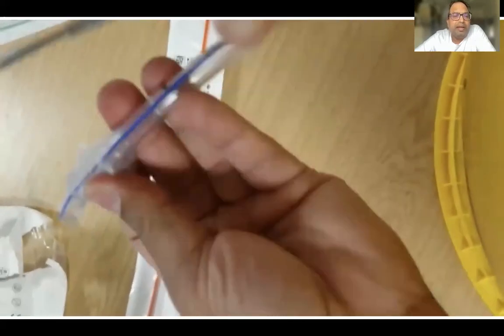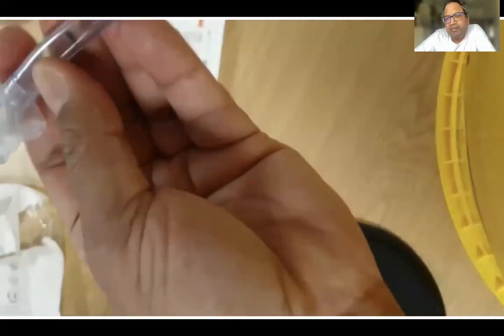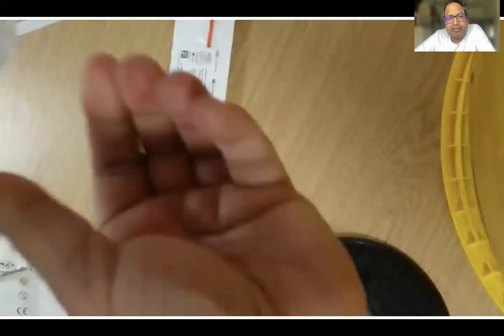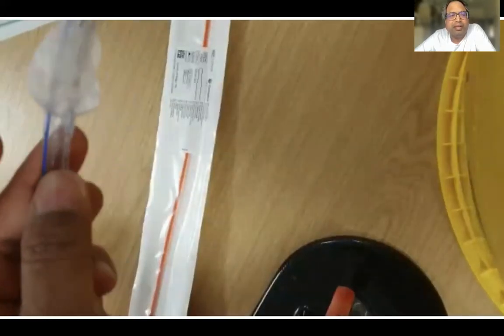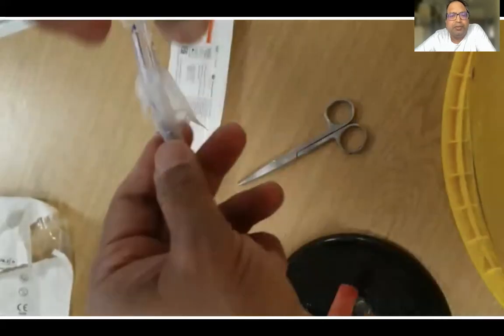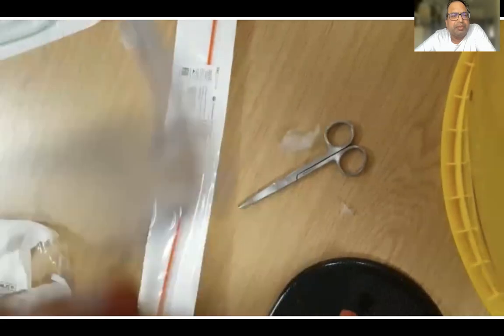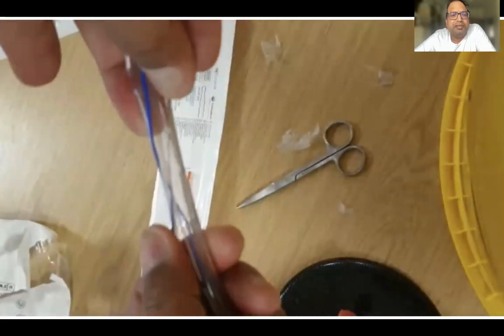Split it till the very end, and you can also rip off the cuff, but if you want to keep the cuff, it's not a problem at all. But it's already damaged, so all you need to do is rip it off, and it totally comes off the whole thing. So you can rip it off completely or just snip it off, so that in the end you have a nice, clean split tube. You'll see that the whole thing comes off nicely. There you go. It's a nice and clean split tube now.